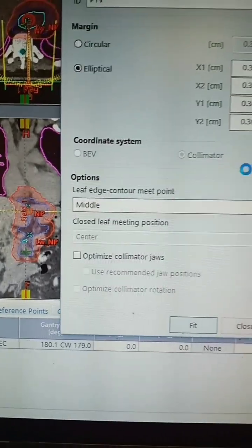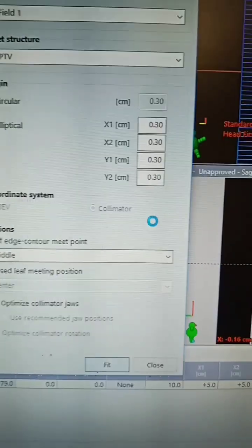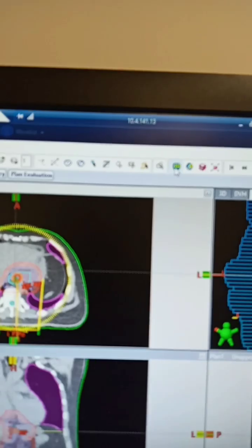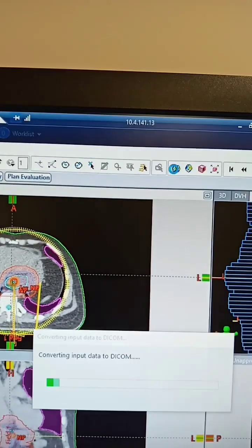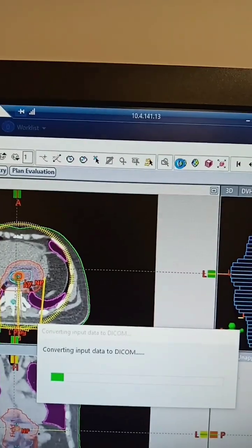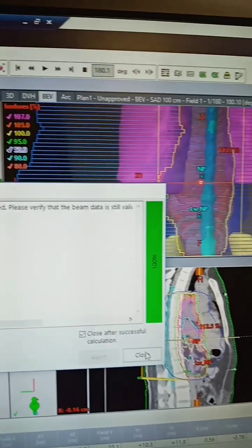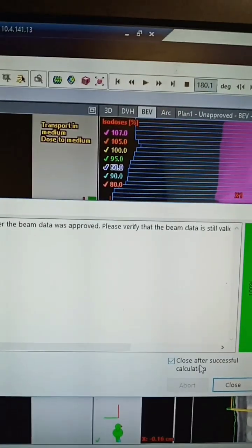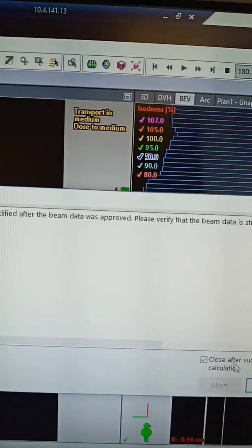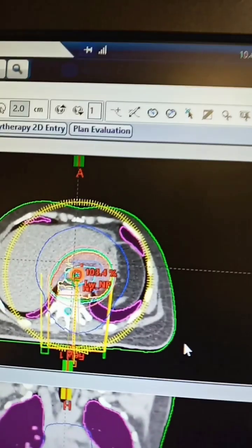It will take some time. Then simply calculate, and this is going to be the result of the field.